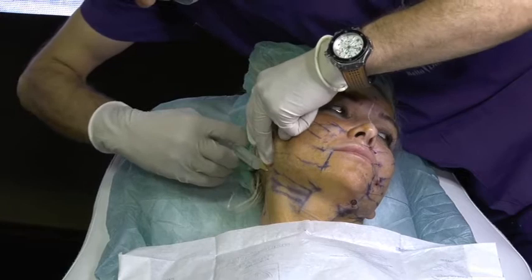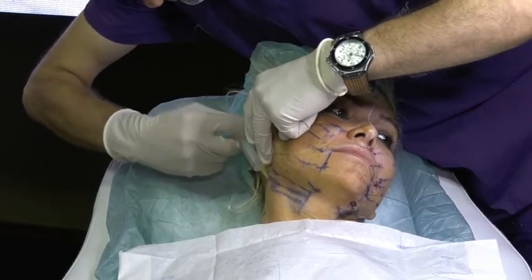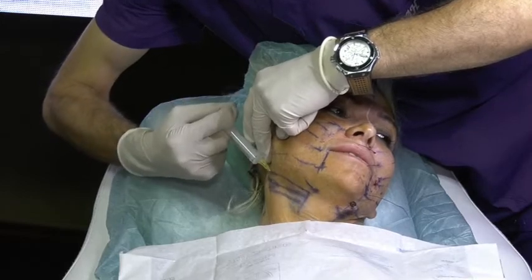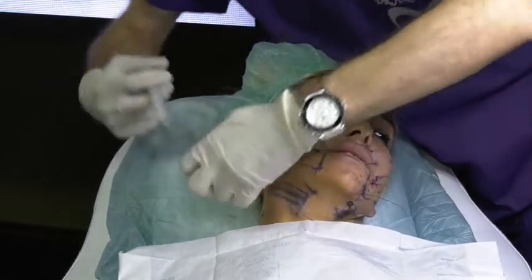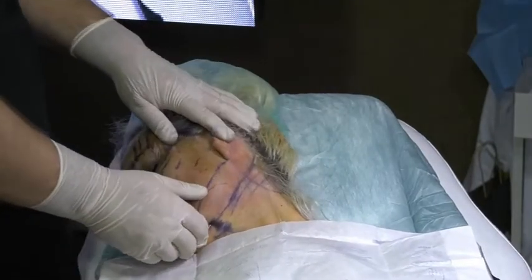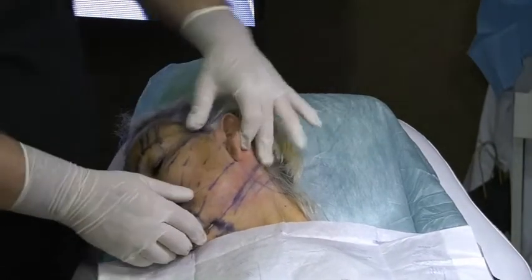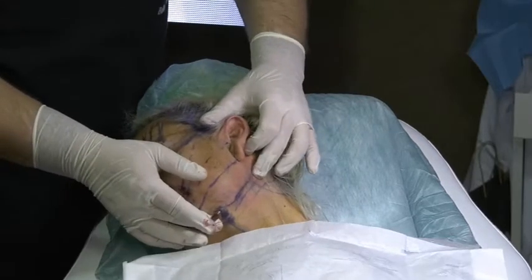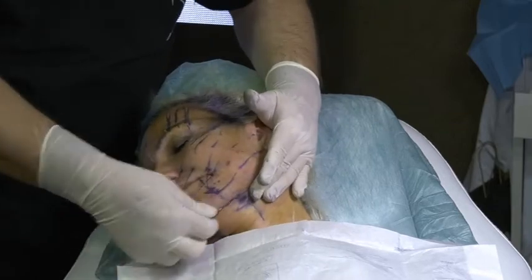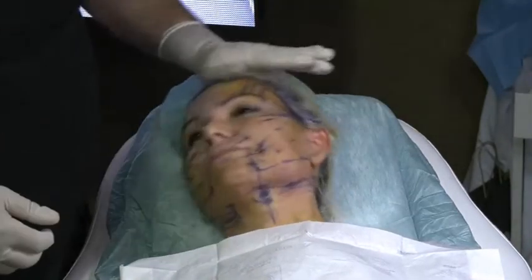I do push. Oh, the cannula is twisted, I can't, no. Slow. Change your direction. Go a little, 1 millimeter down. Slow. Relax a little bit, madam. Yeah, bravo. Thank you so much. Okay, where I am now. Do you see where I am? Okay? It's here. Always press if you want to do more. Press up and push. Okay? Then you lift and go. I'll do the second half.